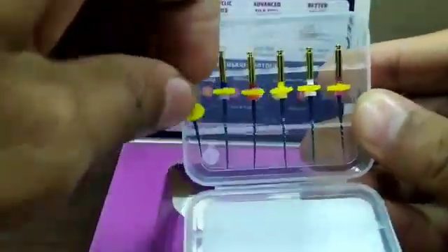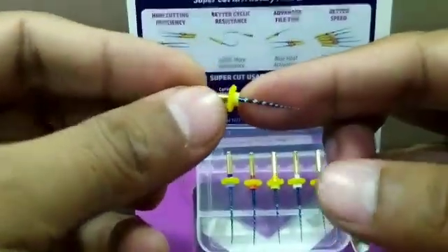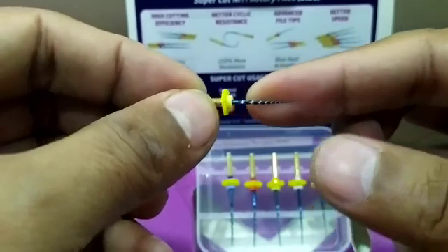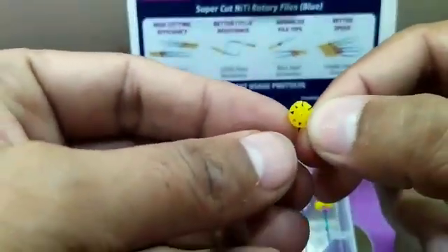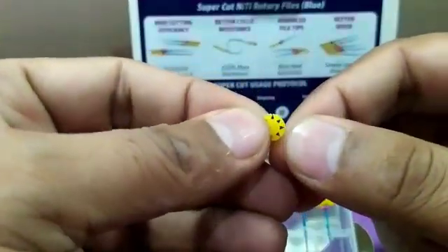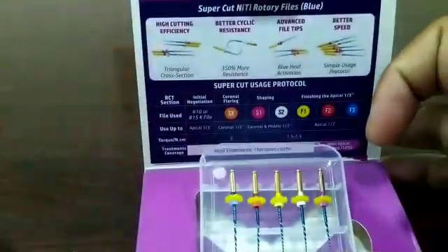Let's take out the first file — this is SX. This file is basically used for orifice shaping, that is the three to four mm coronal part of the canal. There is one special stopper on it. What you can do is, after each case, just pluck out one leaf from the stopper, so you can track how many cases you have done with this file. It's a good indicator.